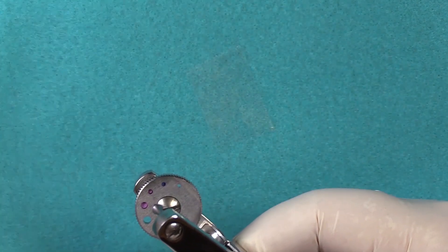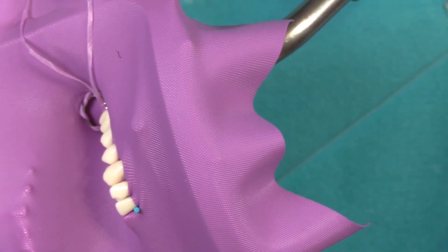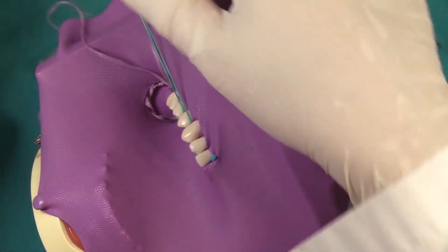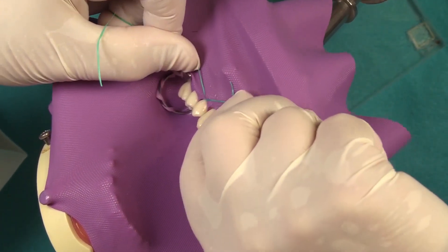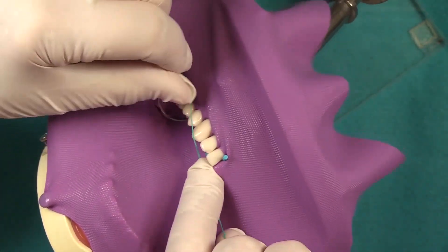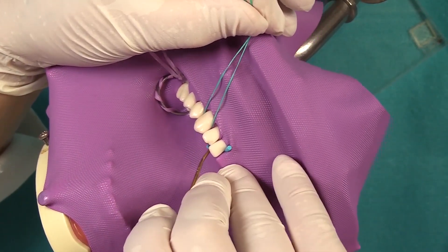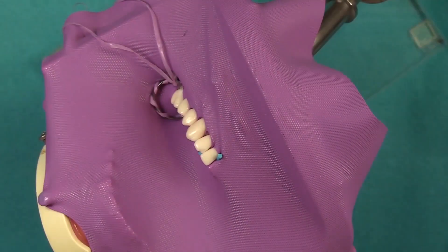As I was showing you, you can do a continuation of that flossing technique — wrapping the floss around the cervical area, holding some tension on the floss, tucking on the lingual aspect of the tooth, and then gently tucking on the facial. You can either remove the floss, or go on to the adjacent tooth and perform the same procedure. This particular trick works very nicely when you have trouble inverting, and usually it's the canine that is the problem. Then you can just remove the floss in that manner.